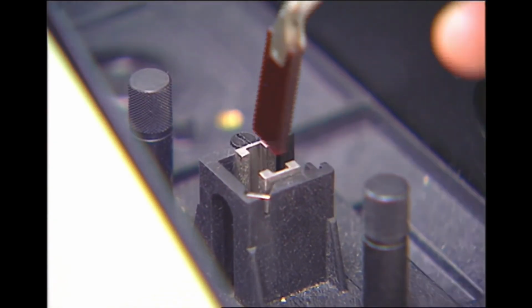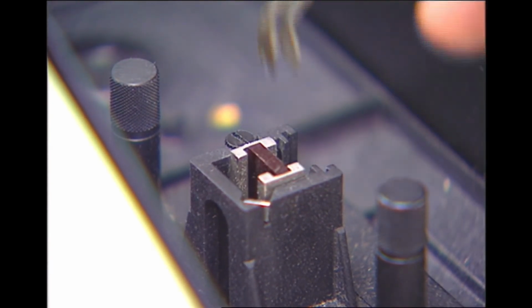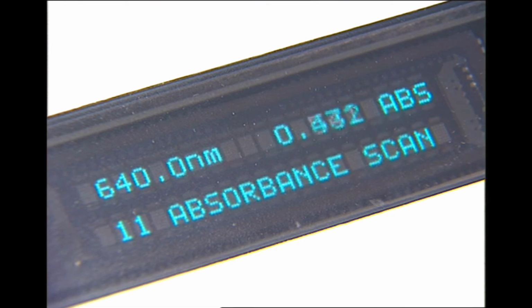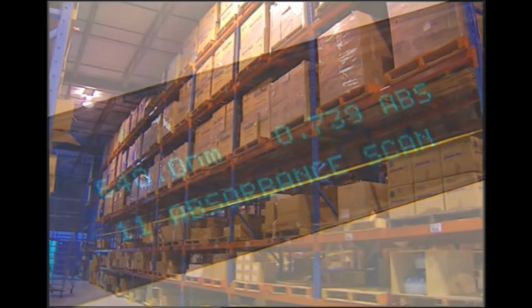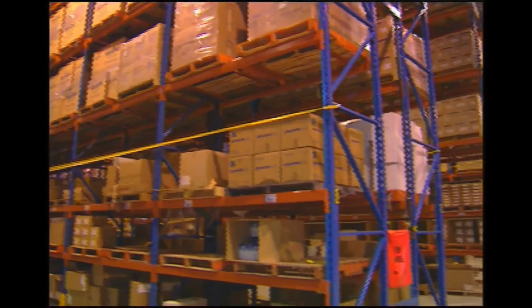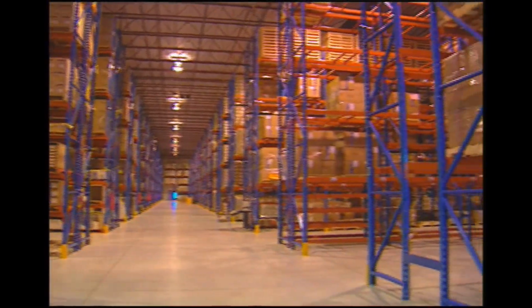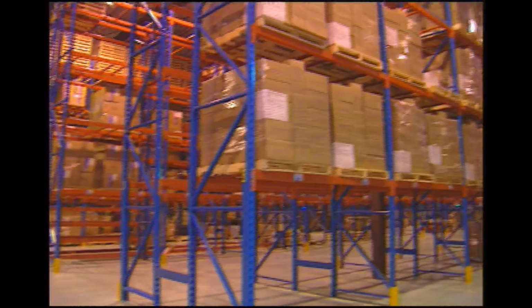IUD. Sophisticated control systems, SOPs, and GMP-trained personnel provide the high levels of quality assurance necessary for our ISO 9001 compliance certification. After QA approval, the IUDs are stored in a GMP-approved warehouse.